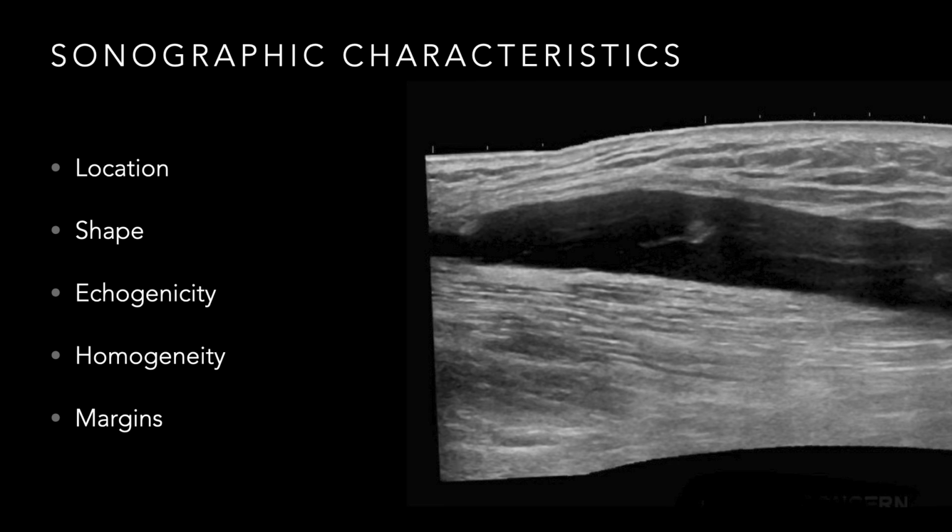There was a nice retrospective review published in the Journal of Ultrasound in Medicine that polled a couple hundred patients with applicable soft tissue ultrasounds, and they looked at the Morel-Lavallée lesions and characterized them based on their findings. All of the patients that had Morel-Lavallée lesions had the lesion located in the subcutaneous fascia interface, right? It's deep to the subcutaneous tissue, superficial to the fascia. So again, it goes along with the nature of this injury. It's a degloving of those two different layers, and then you have the interposition of fluid in that space, right? So they're all in that subcutaneous space.